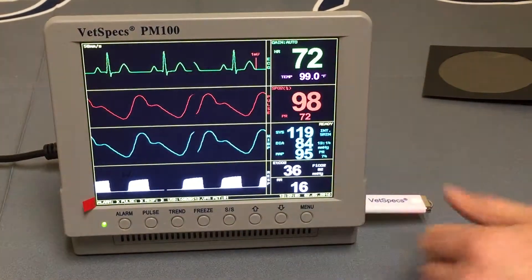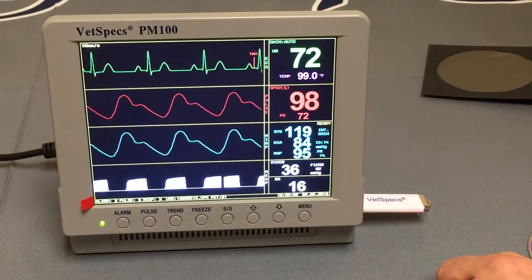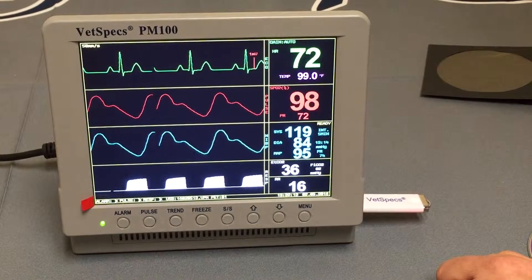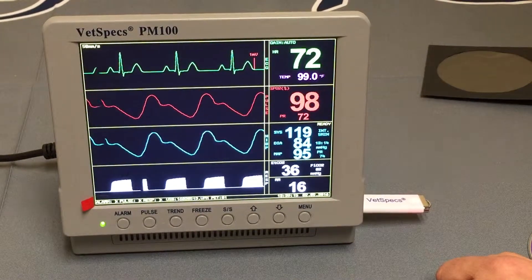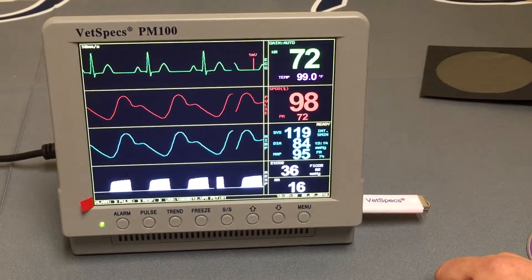That concludes the data saving aspect of the monitor. We will certainly be back in touch on the VetSpecs PM100 and VetSpecs in general as we move on to some of their other products and the other modules available for this system.